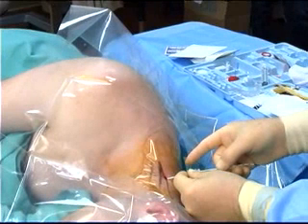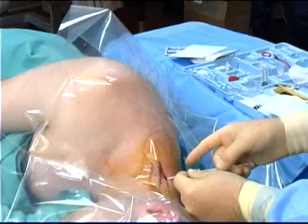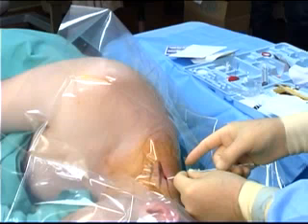Notice that the proximal part of the catheter and the nerve stimulator clip can be placed in the palm of the left hand, which also holds and manipulates the needle. The right hand advances the catheter tip into the needle shaft and beyond.